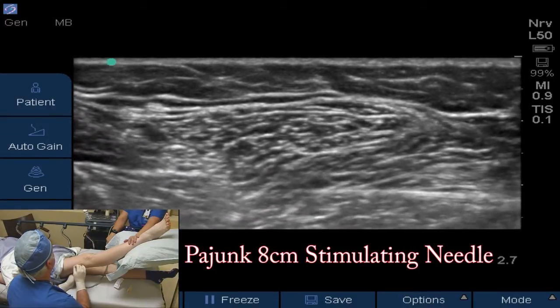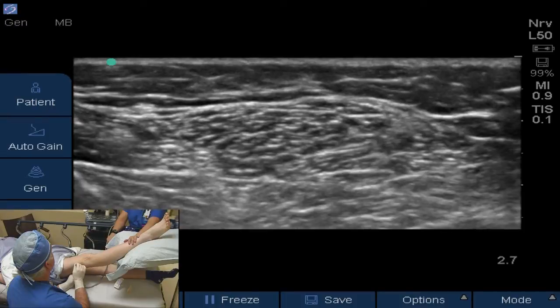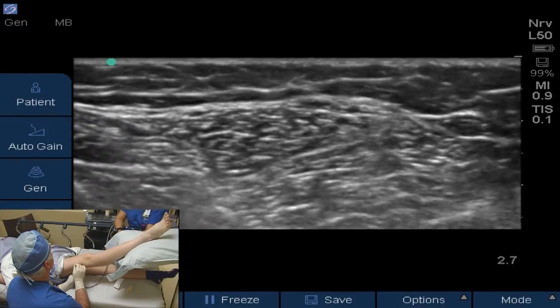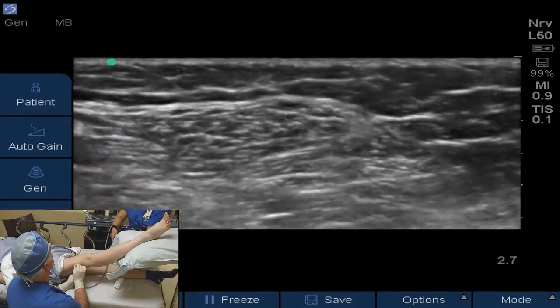We'll come across the screen with the needle from the right-hand side. We can see it approaching, and we may or may not get a twitch when we get close — we probably will. There's a little twitch in the foot; you can see a little dorsiflexion. I want to inject just deep to the nerves here and push them up.